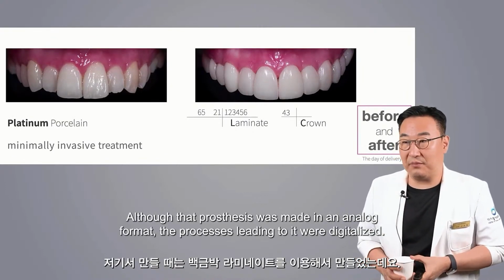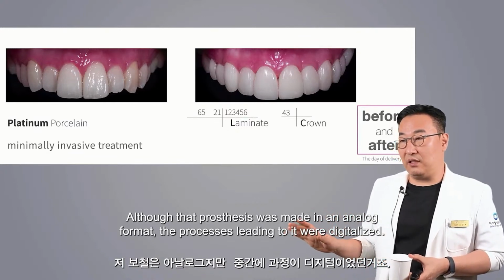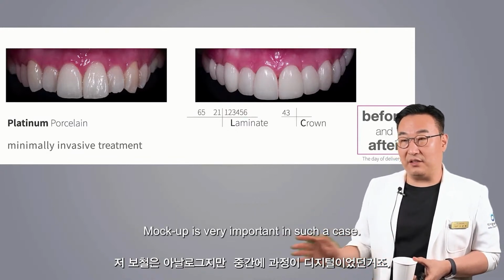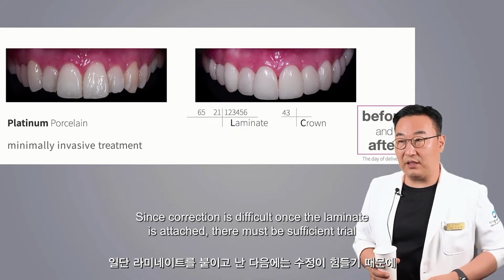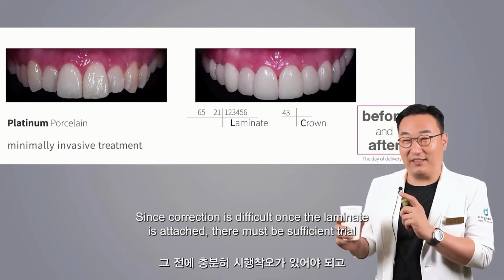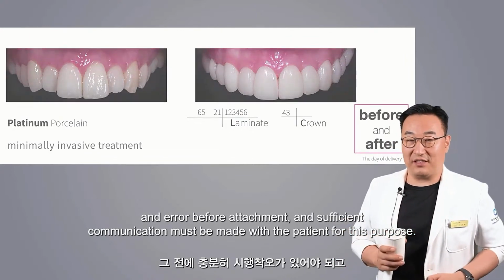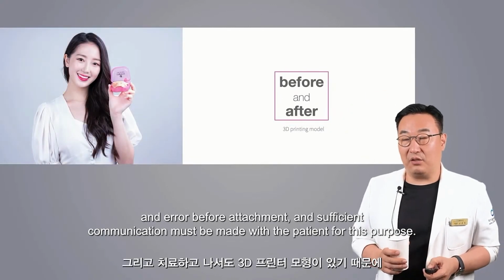Although the prosthesis was made in an analog format, the processes leading to it were digitalized. Mock-up is very important in such a case. Since correction is difficult once the laminate is attached, there must be sufficient trial and error before attachment, and sufficient communication must be made with the patient for this purpose.